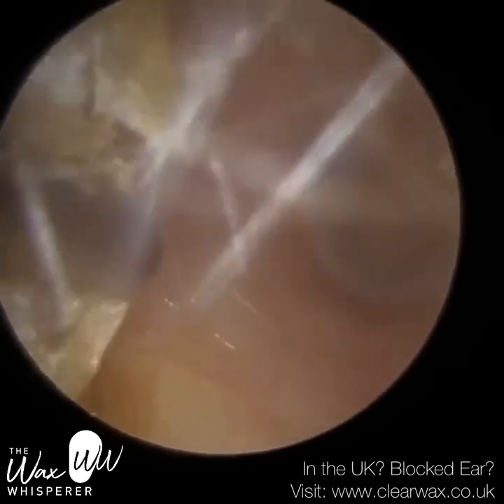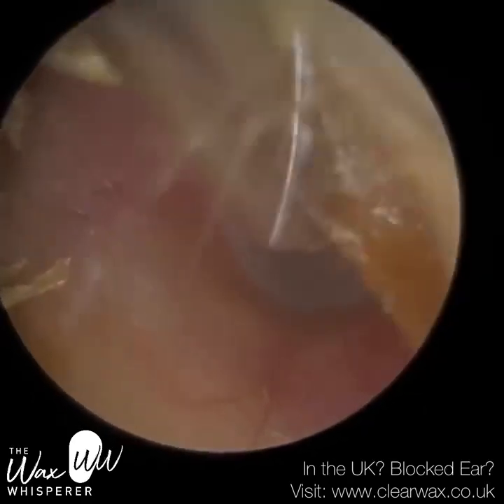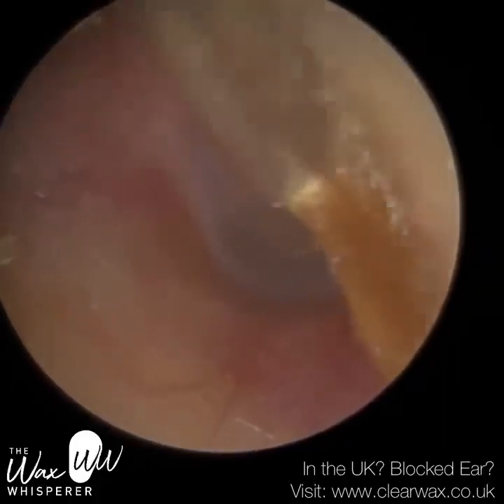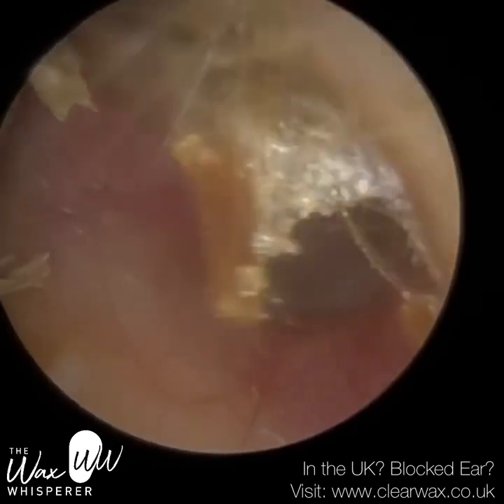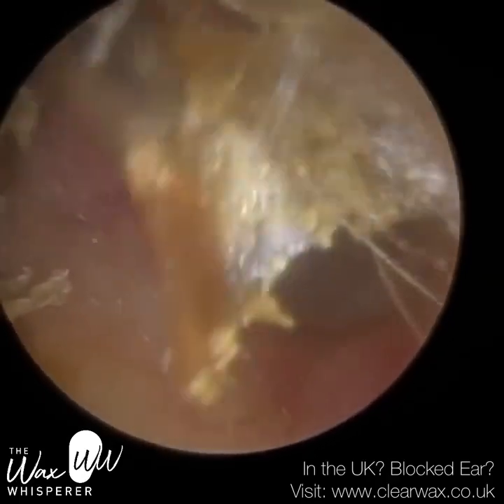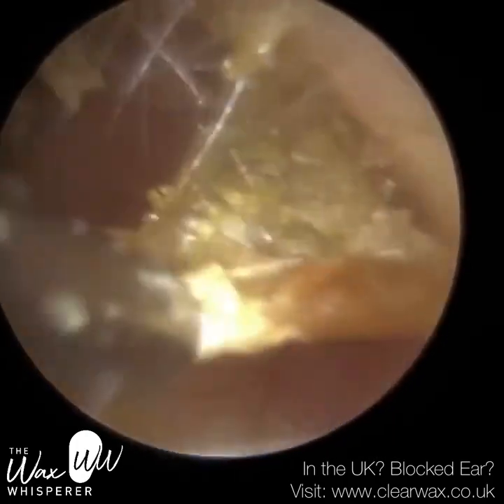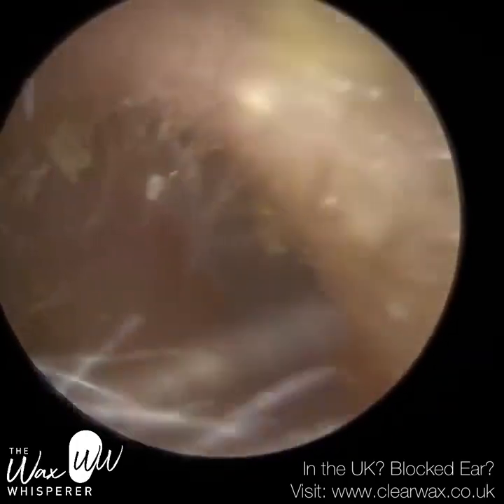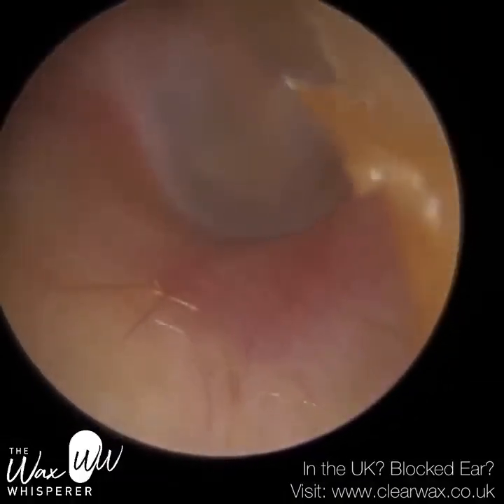There are different suction probes that you can use. So typically for earwax removal, it's the Zollner suction probe, but then there's many different types of suction probes available. The other ones that come to mind are the Fraser suction probe and the McGill. They have larger diameters, are generally longer in length as well. But the Zollner suction probe, it's just perfect for earwax removal.